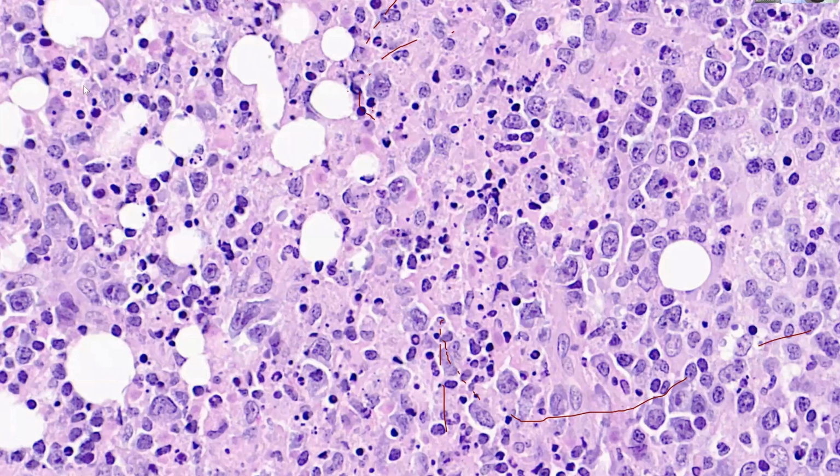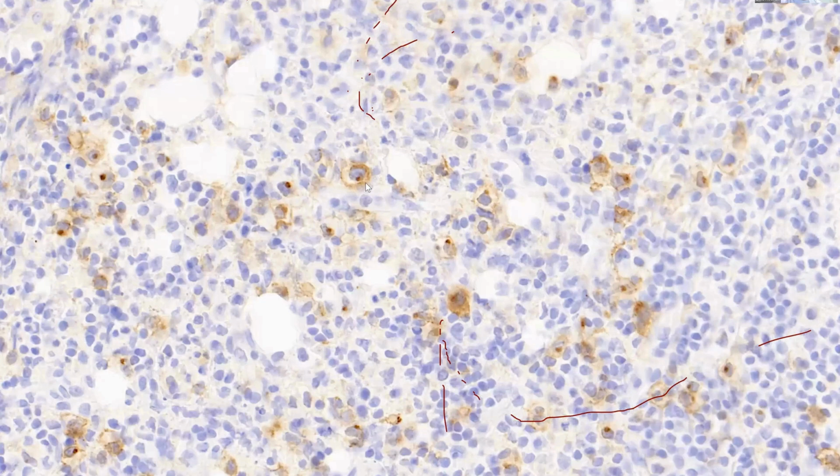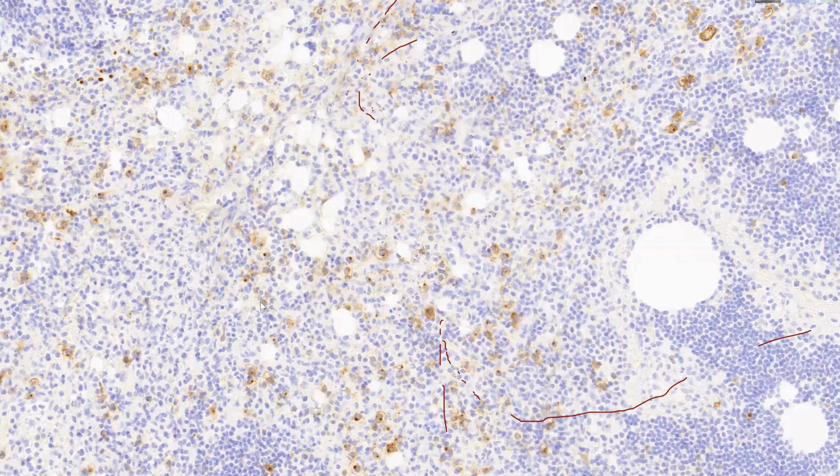This one, I'm just showing CD30 to tell you that CD30 is not a lineage marker. It can be positive in lots of cells, including these cells. Scattered cells show a pattern of membranous and Golgi-type staining, and we ended up calling this peripheral T cell lymphoma rather than anaplastic large cell lymphoma because of this pattern of CD30 positivity. Ideally it should be block positivity, strong positivity, if we're looking at anaplastic large cell lymphoma.